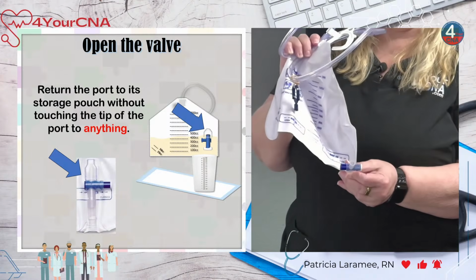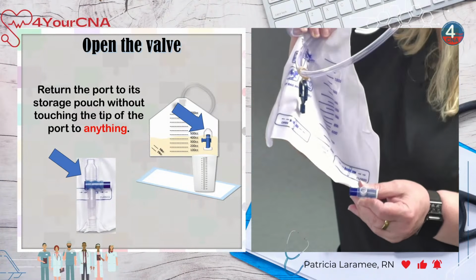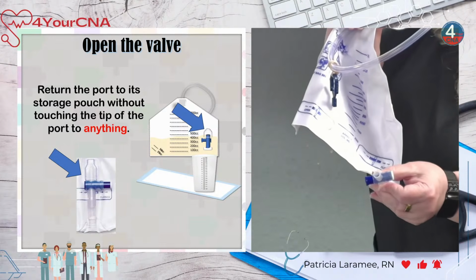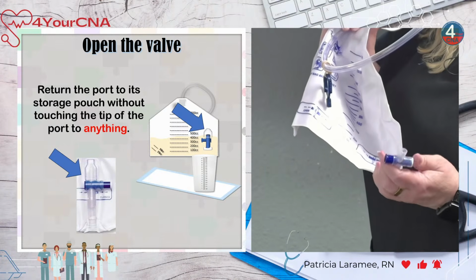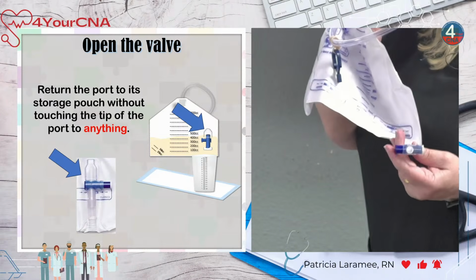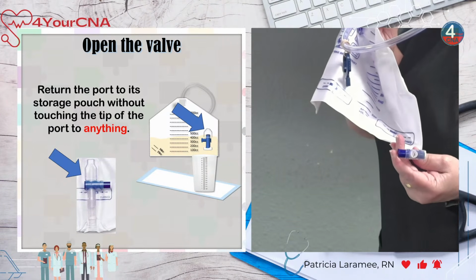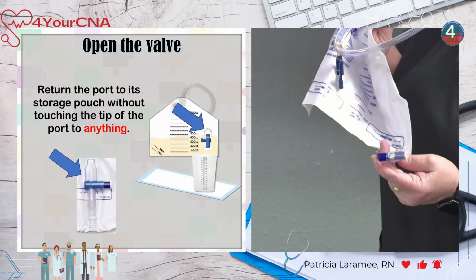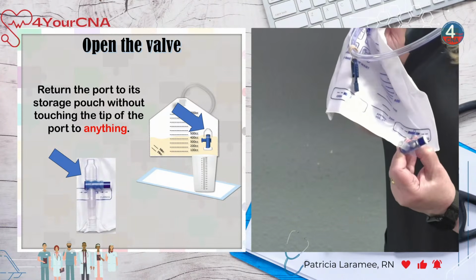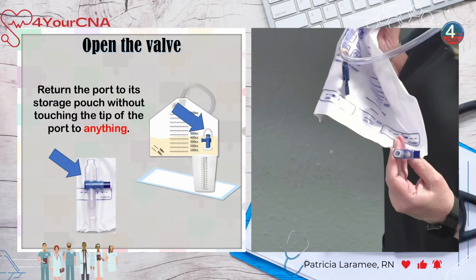And leave it closed so I can show how to work the T-valve. Okay. So if you look inside there, can you see through there? See how it's open? I'm going the wrong way. There we go. See how it's open? If I do this, now it's closed. See how it's closed inside?